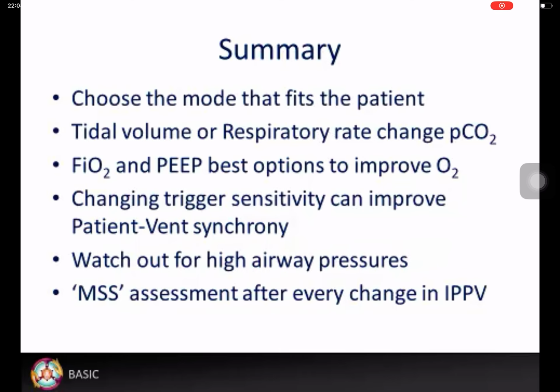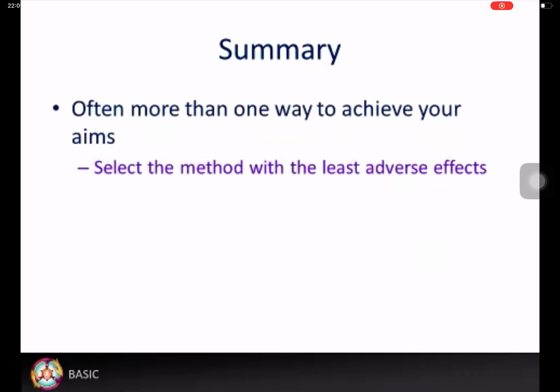Changing trigger sensitivity can improve patient ventilator synchrony. Watch out for high airway pressures. Do a MSS assessment after every ventilator change. There is often more than one way to achieve your aims. Select the method with the least adverse effects.